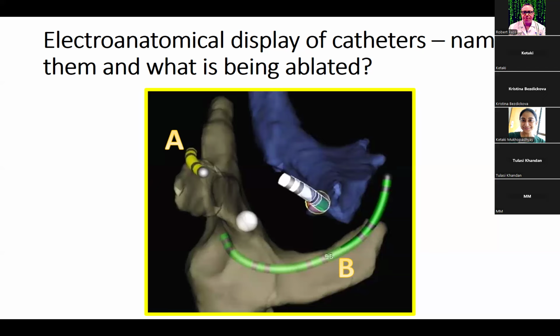Okay. So whenever we're doing a case, let's say someone who has WPW, and I see that the earliest signal is on the distal coronary sinus, I'm usually getting a little nervous because I don't know if it's right near here, or there might be an area way over here that's actually earlier. And the other thing is, it's just hard to stay on the annulus up here.